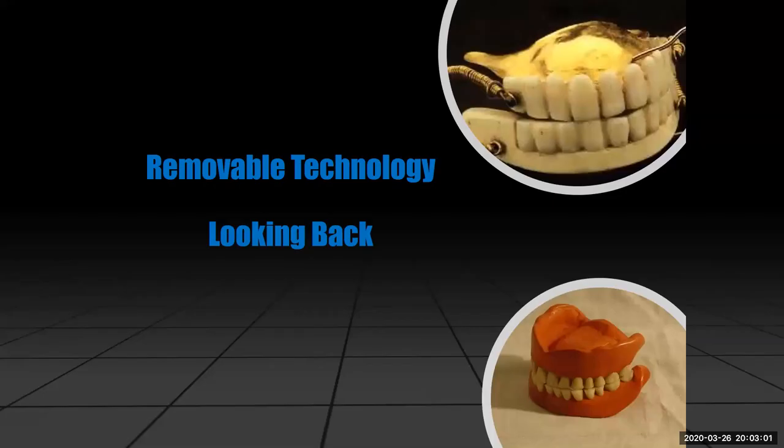Looking back, as we see on the top right-hand part of the screen, those are George Washington's dentures, a long time ago, made out of lead and whalebone. And on the lower, you'll see a denture material that we haven't seen in many, many years, a material called vulcanite. But we've come so far from these materials.